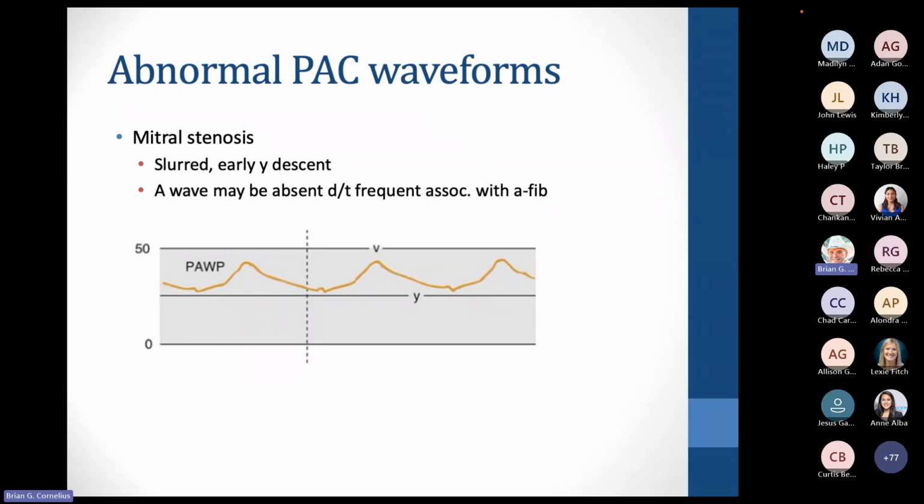Likewise, when you start looking at cardiac surgeries, you'll see that it's fairly common to have to cardiovert patients that are having mitral valves either repaired or replaced. So just keep that in mind. Usually those patients, they're going to have their chest open already, and you're probably not going to be the one defibrillating them. Usually the surgeon will take care of it.